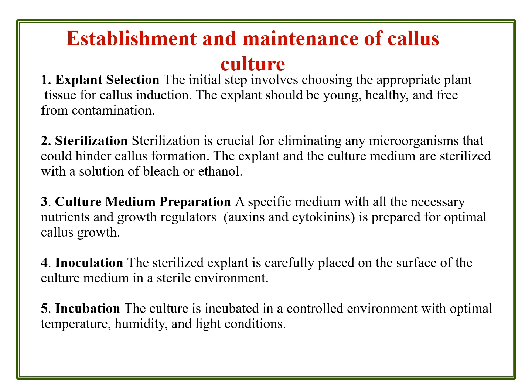And then incubation. The culture is incubated in a controlled environment, usually 25 degrees centigrade plus or minus one degree centigrade. The culture maintenance room is usually equipped with air conditioning. Prior to placing the culture plates, culture bottles, petri plates, or culture tubes, 24 hours before, the culture maintenance room is sterilized with fumigation.